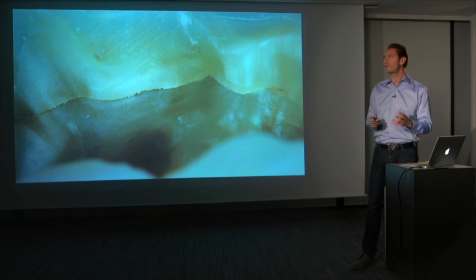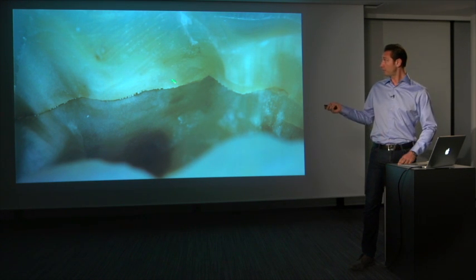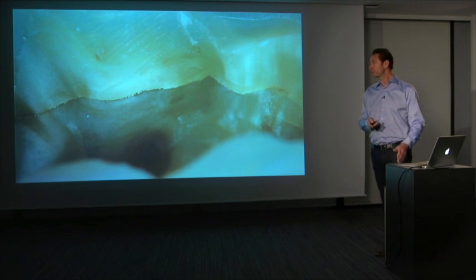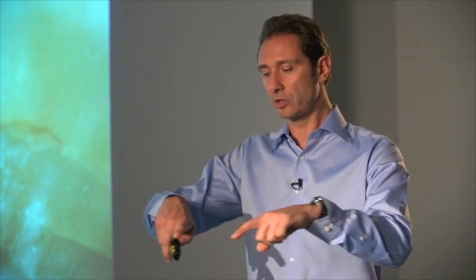There's no way ever we could seal off a crack completely from the inside. So the crack needs to be cleaned out, removed. We have to have a clear view of what is happening, and especially we need to be sure that the outer contour finally will be sealed. There, we should leave no chance of infiltration of bacteria from the outside to the inside.